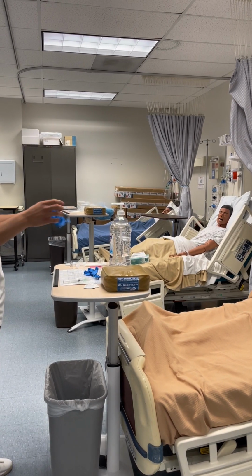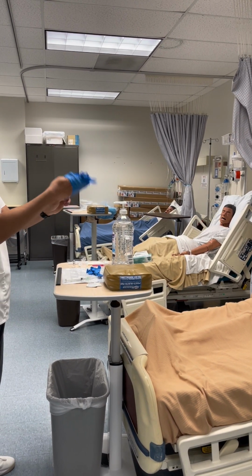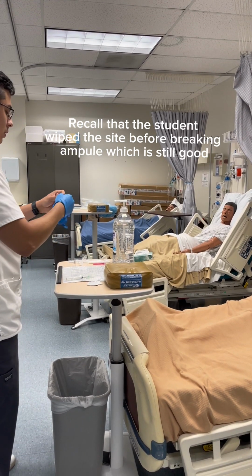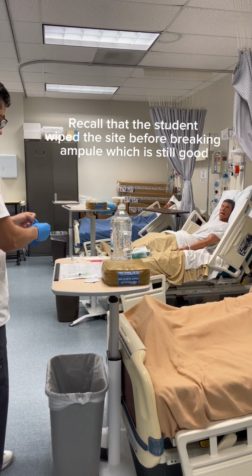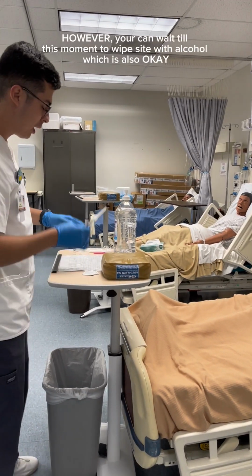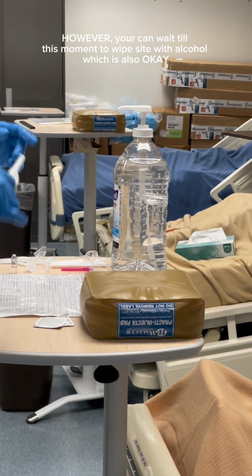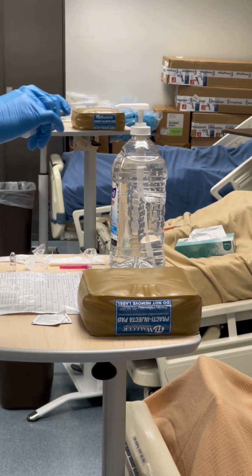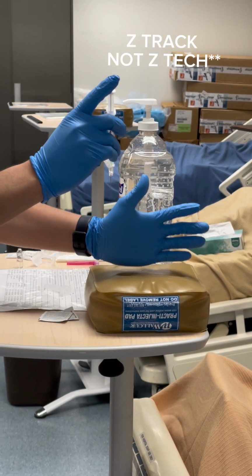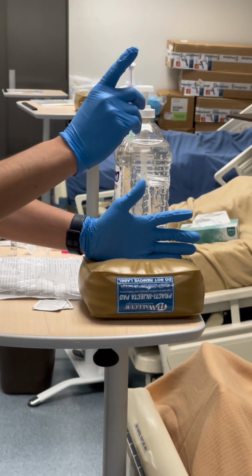Okay, so I did wipe the area with alcohol already. Since I already wiped the area with alcohol, his right deltoid, you're going to feel a slight pinch. Okay, I'm going to use Z-track. Z-track.